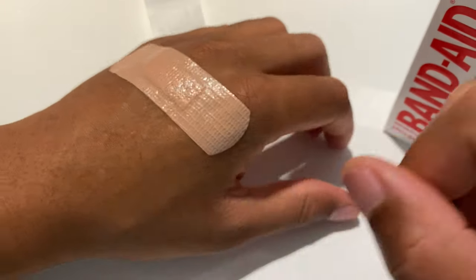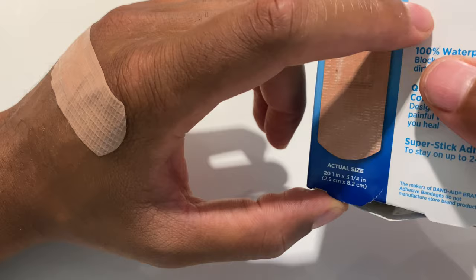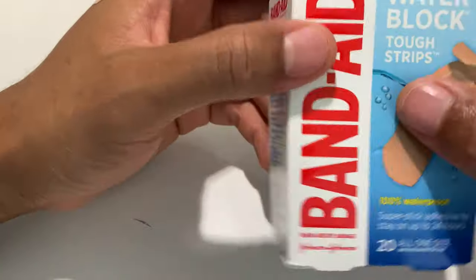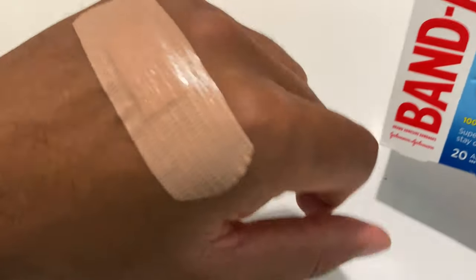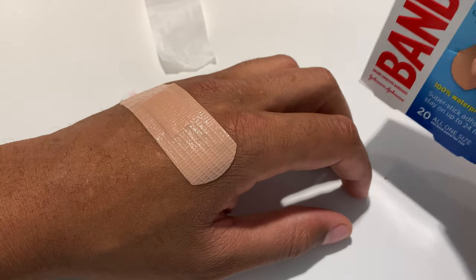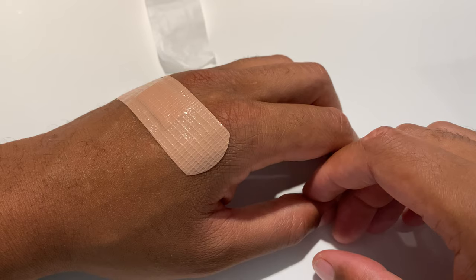It's waterproof, so I feel comfortable rain or shine. That is the Johnson and Johnson Band-Aid Water Block Tough Strip — this is what it looks like. It feels comfortable, and it's nice knowing that I am waterproof now along that area. I hope this was helpful — thanks a lot for watching.